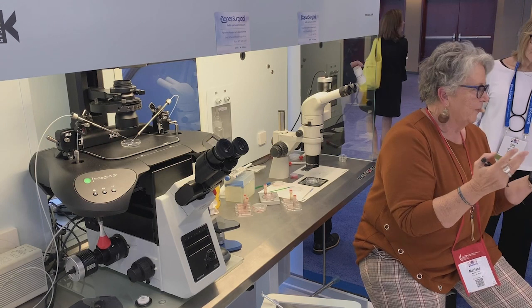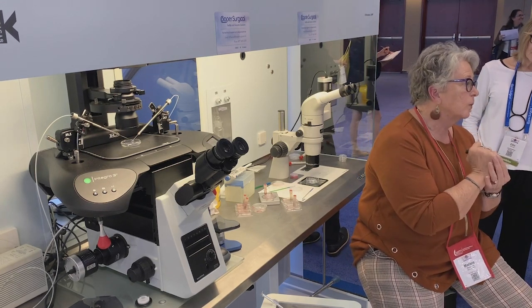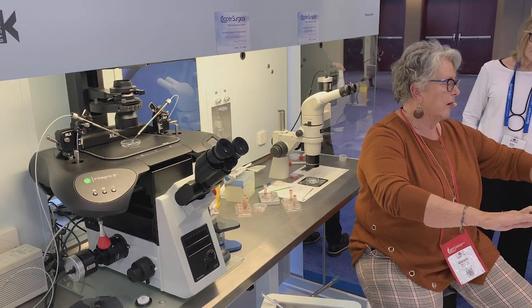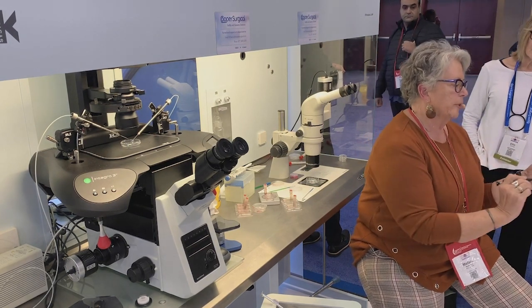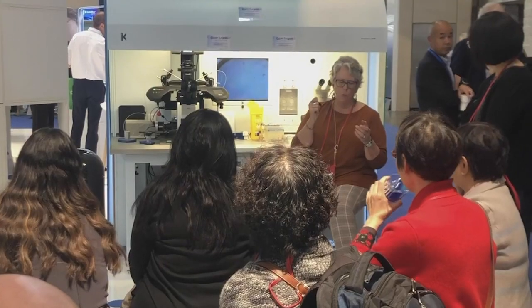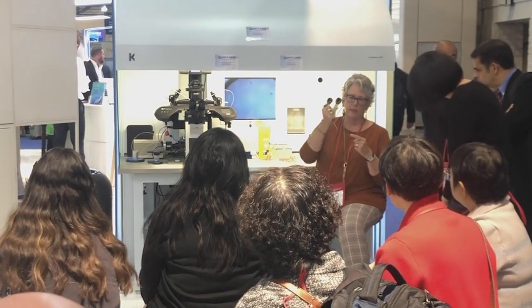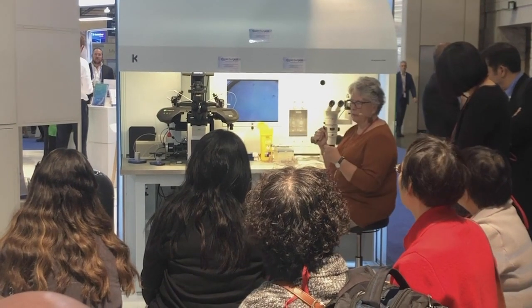So rather than trying to scrape it up, which is often what you have to do if it's flattened out and completely adhered to that CryoLock or to your VitriGuard, I don't want to have to do that. So one of the tricks that we use is I'm going to pull it up just past the end, and I'm just going to sort of tap it down onto there.